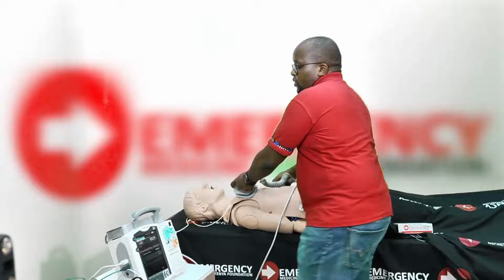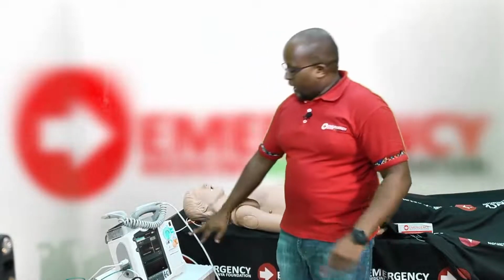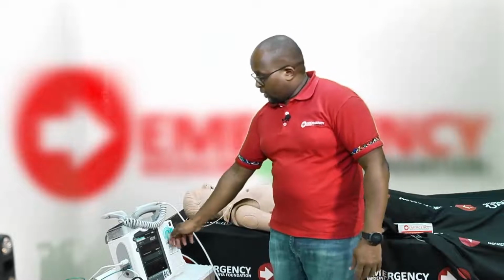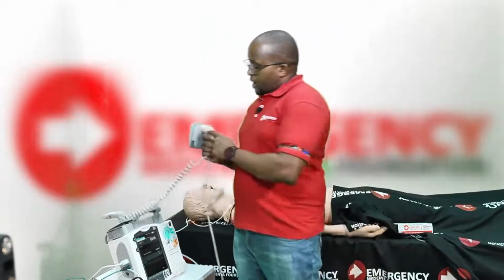Now, there are three steps to defibrillation. Okay, step one, and actually it's labeled step one. Step one is select energy. How many joules am I going to use? For an adult, I'll use 150 joules. Step two is charge. Charge can be done from here, or number two here.